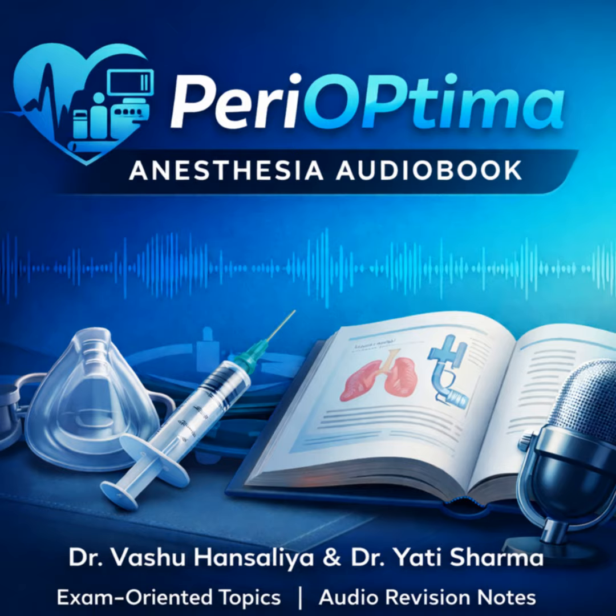This is the bane of my existence in the OT. Sometimes the needle is a bright white lightsaber, and sometimes it's just completely invisible. That is the concept of anisotropy. It sounds like a sci-fi villain, but it's just physics.